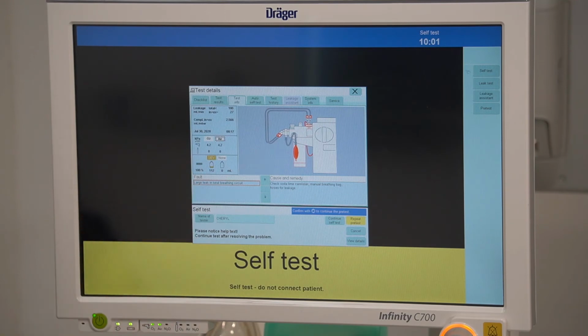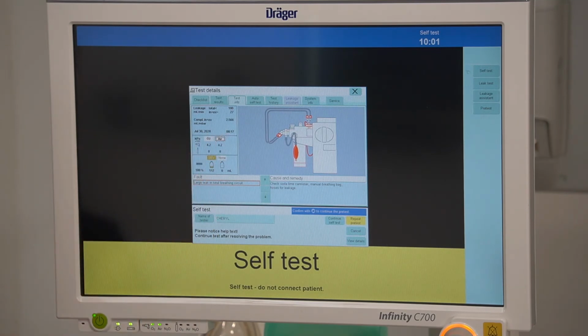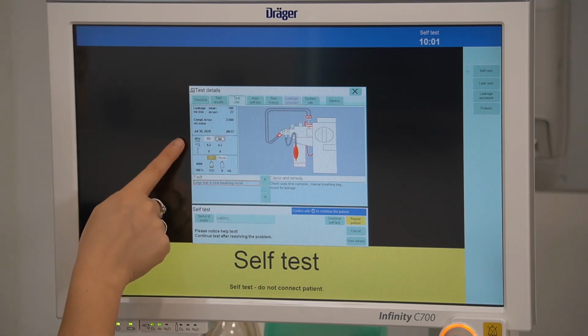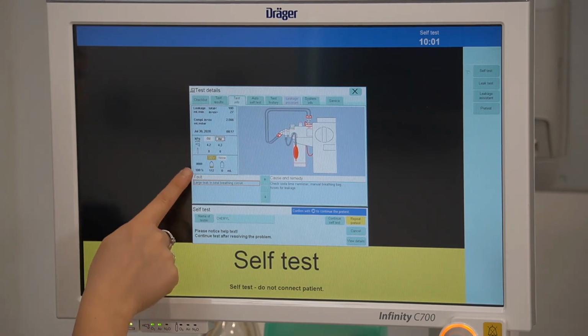To check your Y-piece has a HME filter and is connected to the self-test adapter, verify that a filter is in place and connected to the Y-piece of the breathing circuit and attached to the test cone adapter.